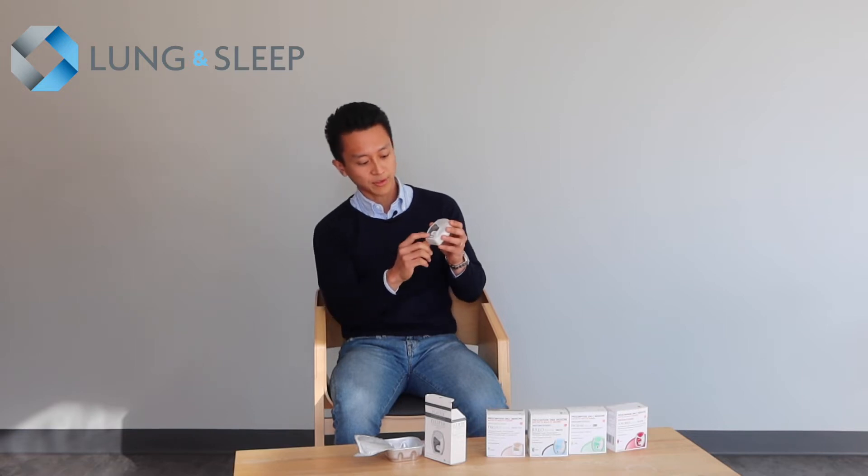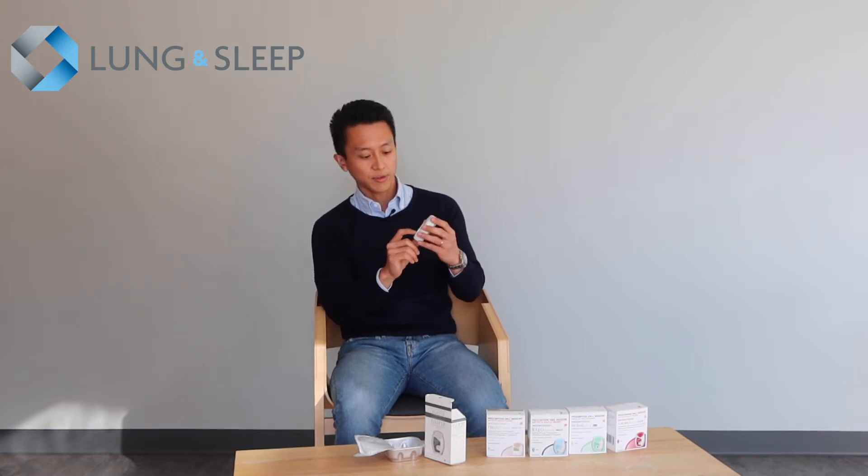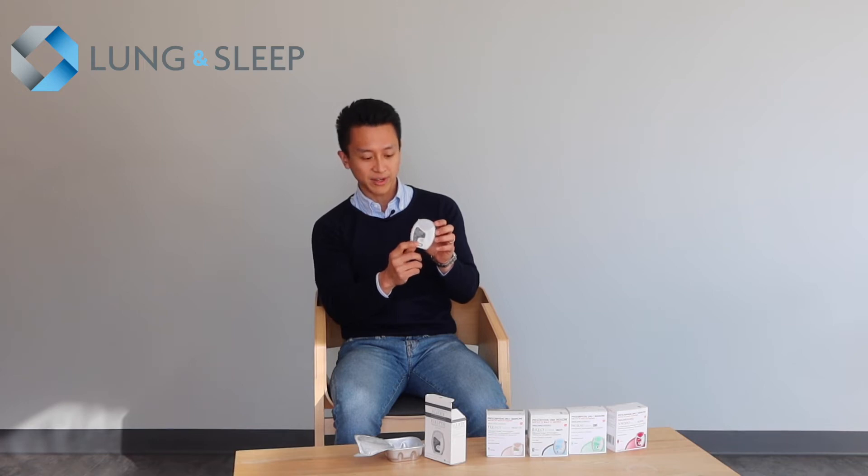It comes with a lid that flips open and a dose counter at the front. It starts off with 30 doses when you first get your device dispensed.